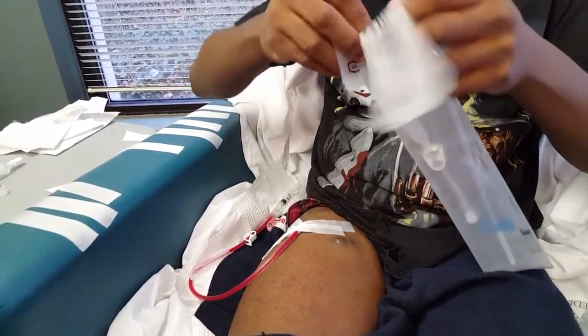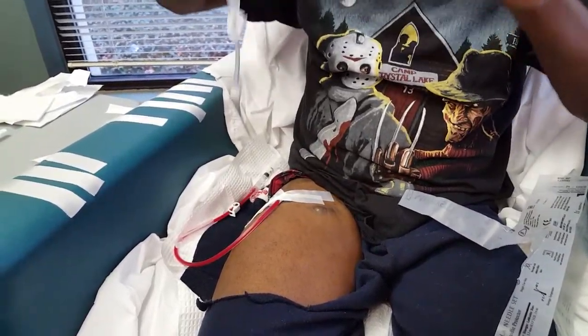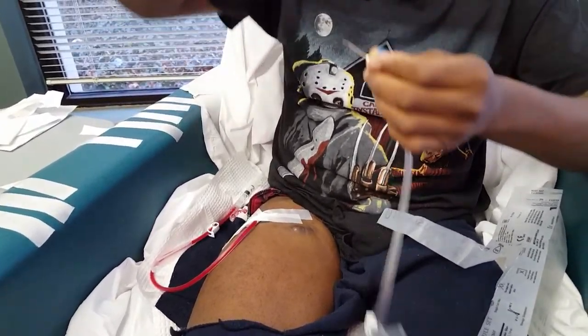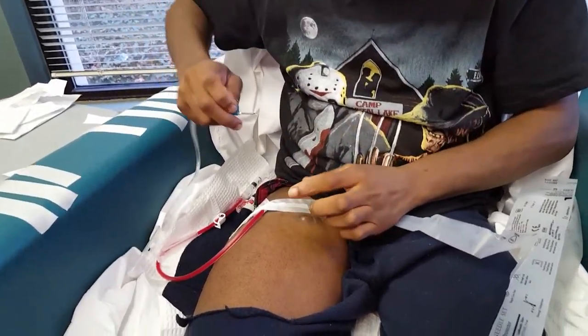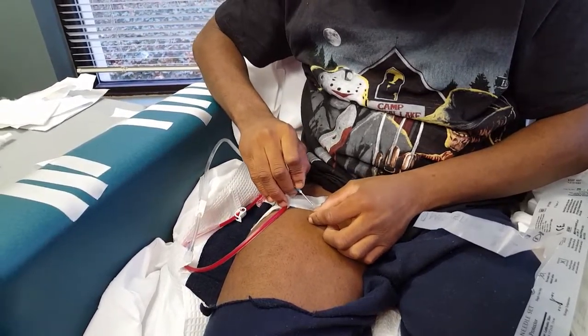Now we get the other needle. Open it up. Did a good job for her, didn't he? And I didn't even make a mess this time. So the good video job. Don't run out. And then, that in there. Take this, and make sure where it's at before you go in.